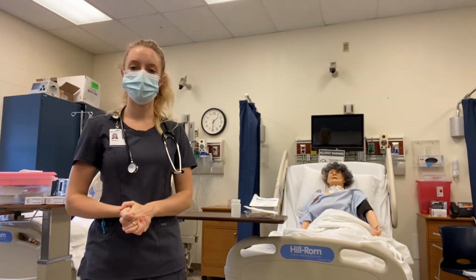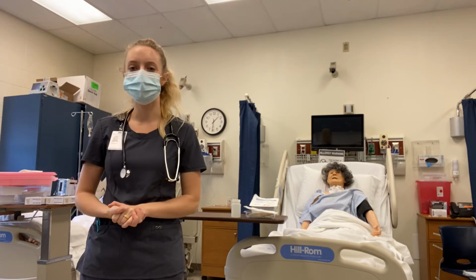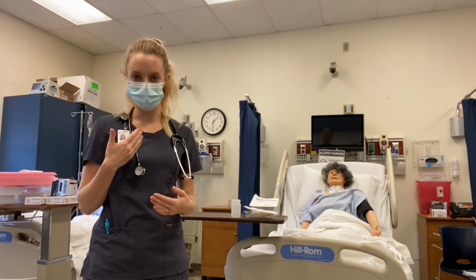I am a 7th semester nursing student, and today I will be demonstrating the nursing skill of tracheostomy care. The first part of this will be providing suctioning.